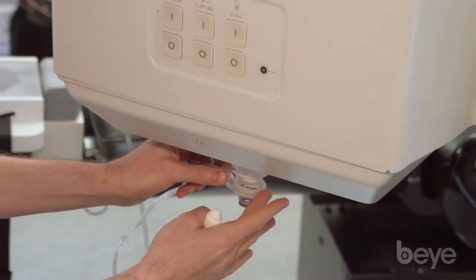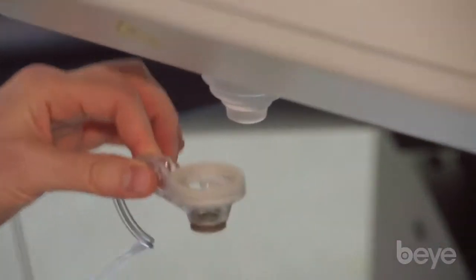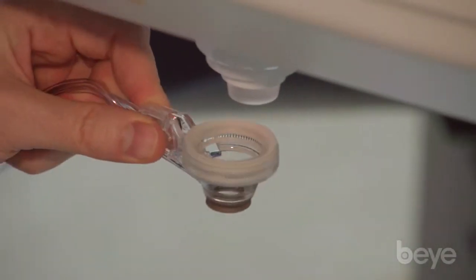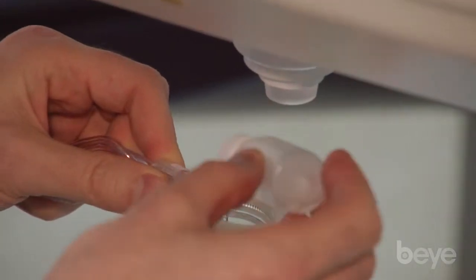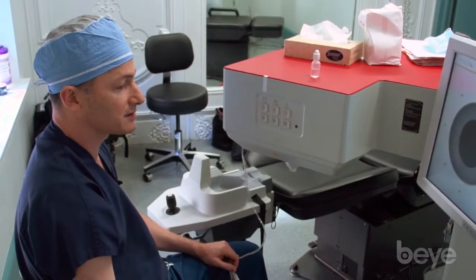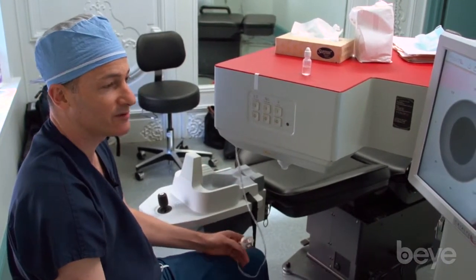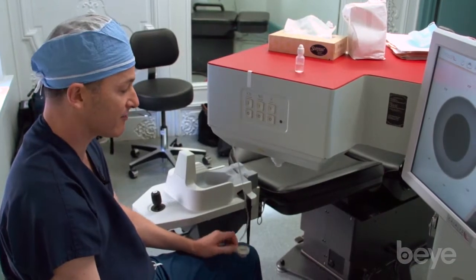The liquid optics interface is very gentle to place on the eye and very comfortable for the patient. It uses Balanced Salt Solution. Once we have a light suction on the eye, we apply water and the water acts as a lens to connect the eye to the laser, allowing for a very painless and comfortable delivery of the femtosecond laser energy in a safe manner.